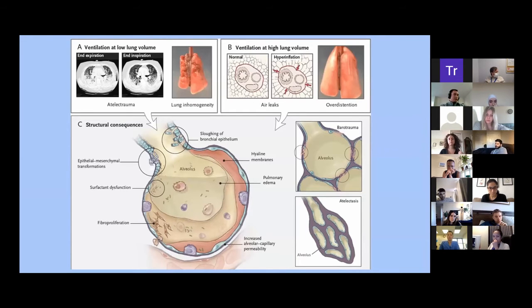Now, we're going to touch very quickly on ventilator-induced lung injury. I think this is very important for everyone to feel comfortable understanding. The best mechanical ventilation is no mechanical ventilation. We always preach that as intensivists. It's always bad to keep patients for long periods of time on positive pressure because we end up harming them. One way we can harm them is, for example, with low volume ventilation, we can cause atelectotrauma. Another way we cause atelectotrauma and create areas of atelectasis is by providing no PEEP whatsoever. That's why we always keep a PEEP of 5.